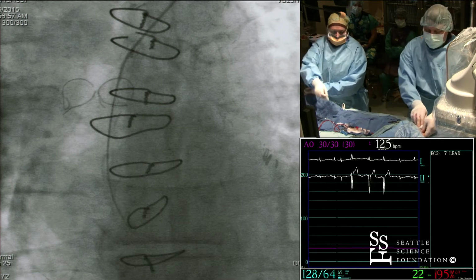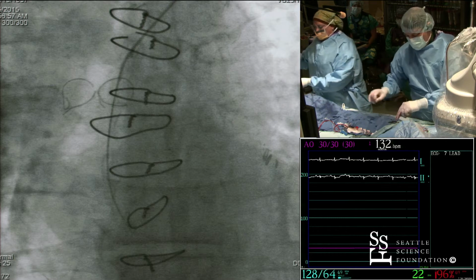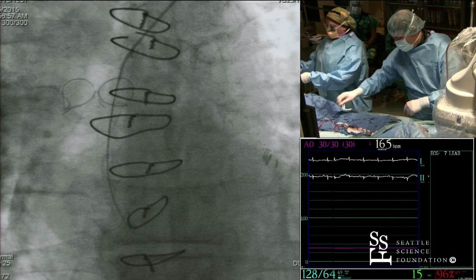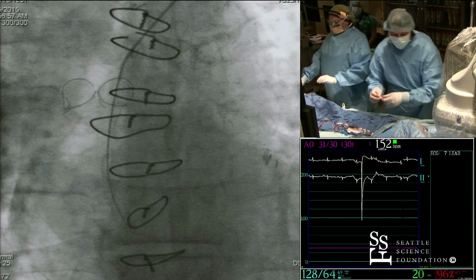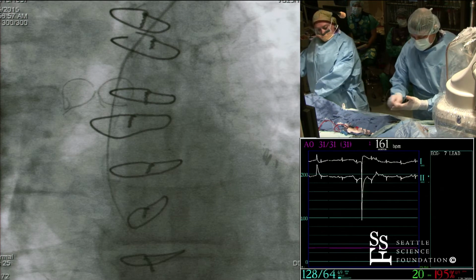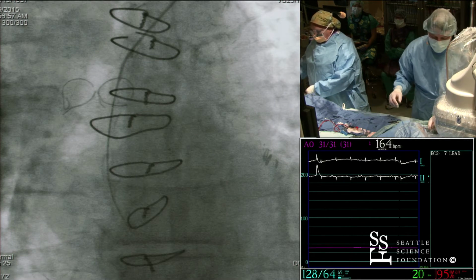Now the other thing was we gave heparin. We gave 5,000 units of heparin, and we traditionally have done that. We'll talk about the data that supports doing that for the radial approach. I don't know if Mauricio brought that up in the overview or not, but we can talk about that later. That's a really important aspect of reducing radial occlusion.